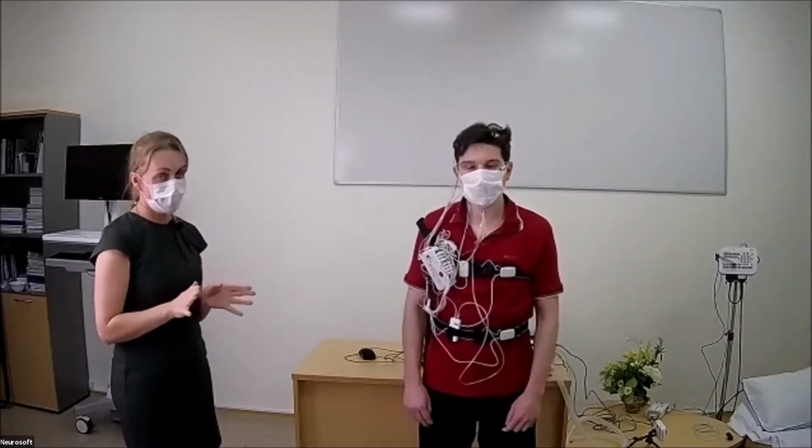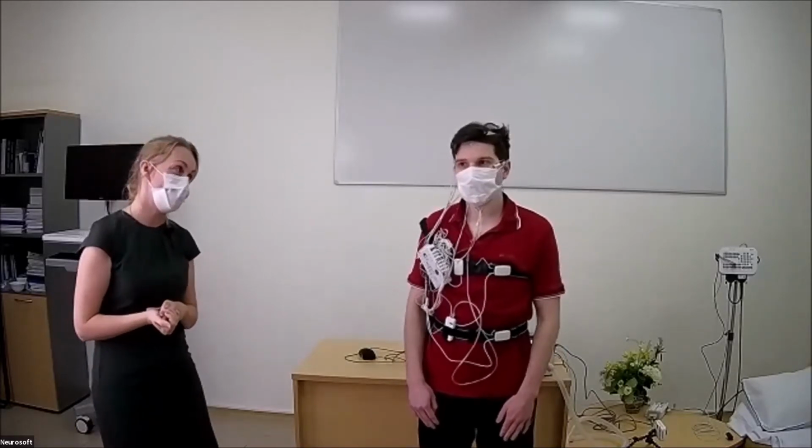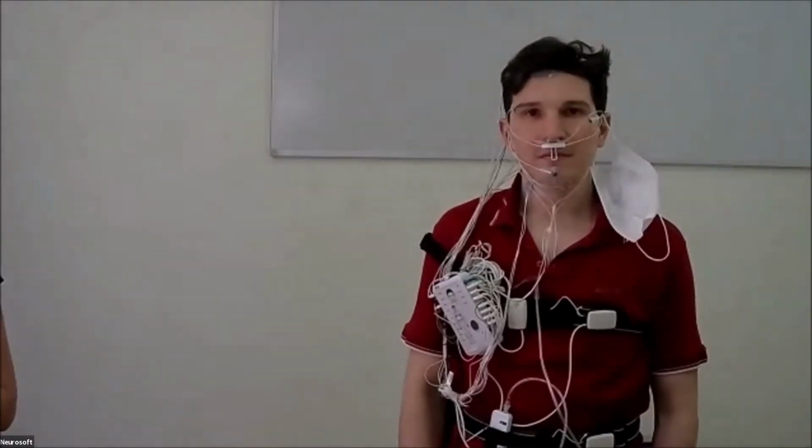The first derivation, which is very important, is airflow. We have 2 different sensors which we can use for airflow measuring. It could be a thermistor, or it could be a pressure transducer with cannula. In accordance with the recommendation, the thermistor is recommended for apnea detection, and the cannula or pressure transducer sensor is recommended for hypopnea detection.